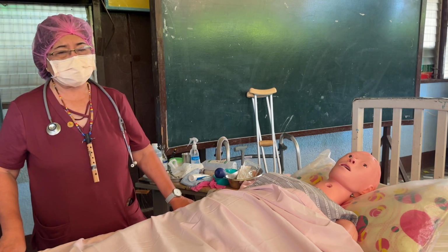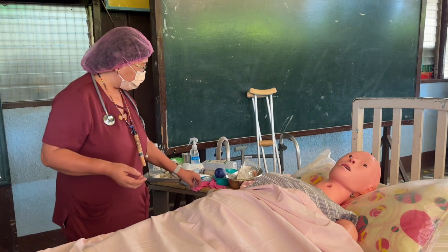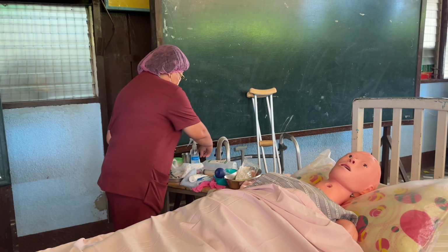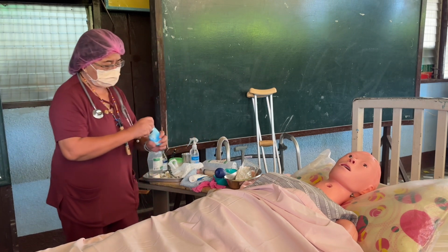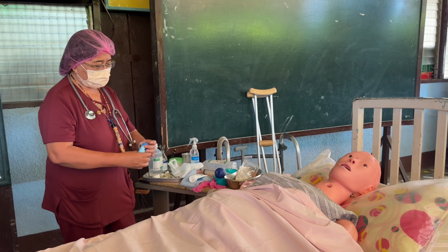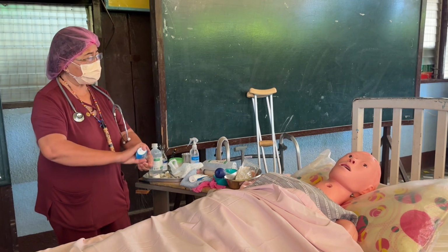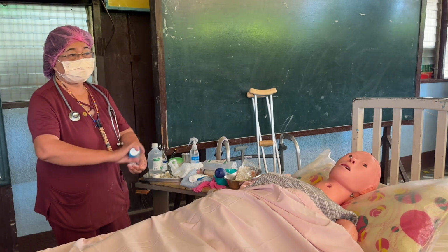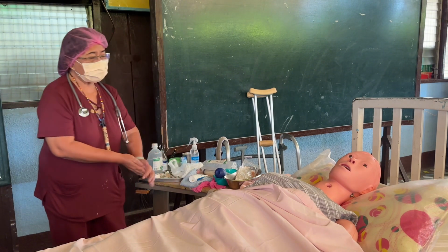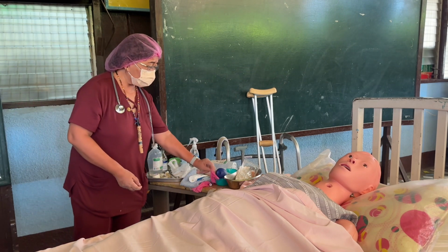After gathering all the data, we're now going to put on clean gloves before we enter the patient's room. Why? Because we're going to hold the patient, check the patient's wrist tag, take the patient's vital signs and adjust the backrest of the patient. That's why we already have to use clean gloves.